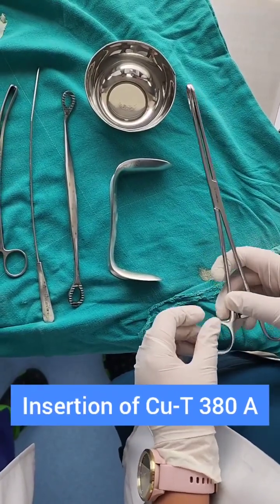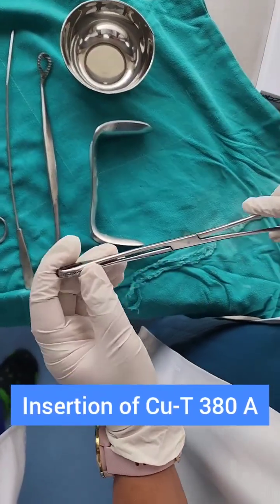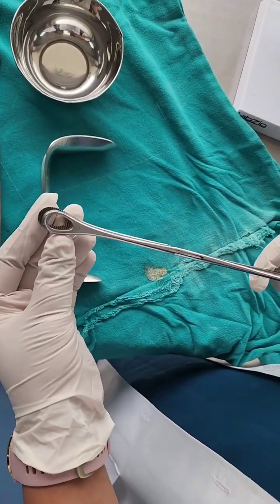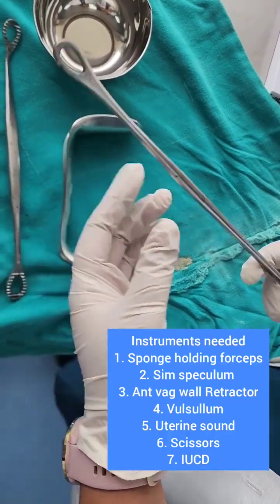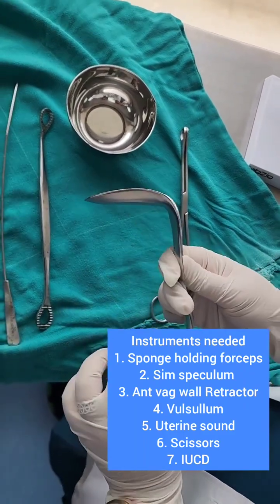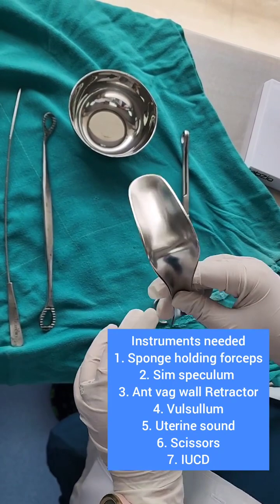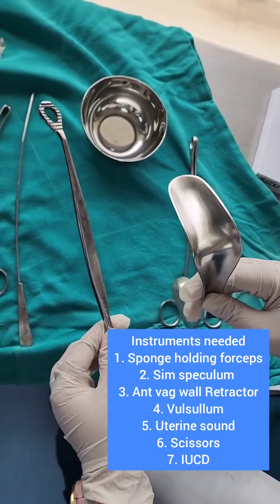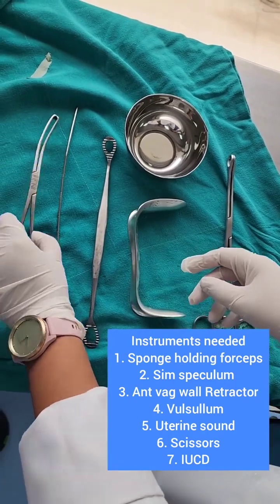We will show you how to insert a copper T. First we need to know the instruments used to insert a copper T. We first need a ring forceps or a sponge holding forceps, which we use to clean the area. Then we use a Sims speculum — we can also use a Cusco's but preferably a Sims speculum should be used, along with an anterior vaginal wall retractor.